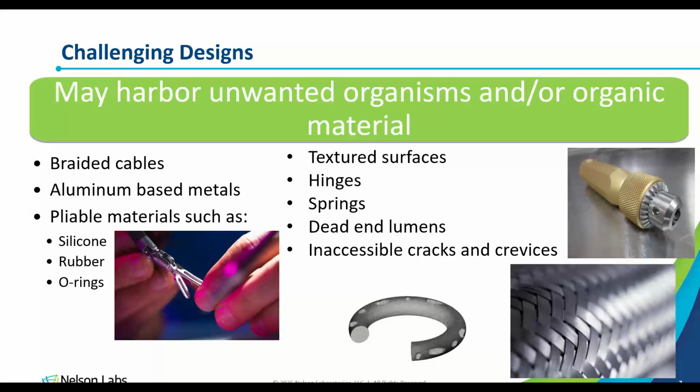Those are pretty typical time ranges for ultrasonic procedures. But I would definitely plan on having an ultrasonic step in your instructions for use. But again, if you can disassemble your device, that is going to greatly increase your chances of passing.